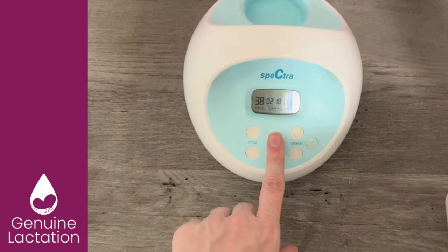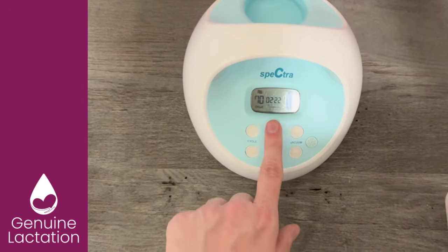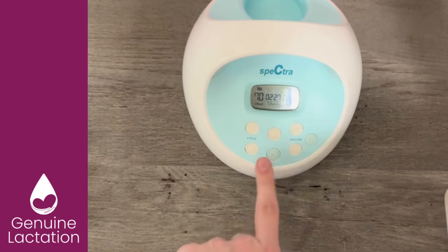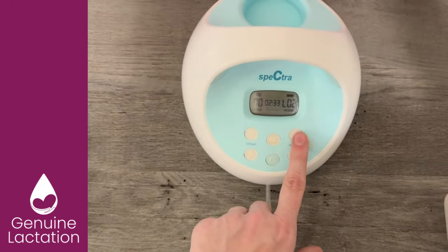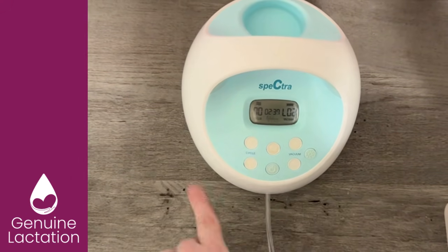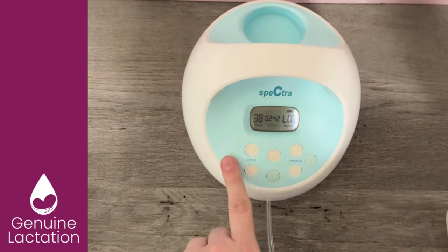Once you are seeing that milk is just trickling because we've moved most of the milk from that letdown, we're going to again hit that massage button. If you feel like it's too strong going back, go ahead and drop it down again. If you need to drop it down 2 levels, that's fine. Some people need to adjust their settings with every letdown, some people don't. So again, once you see milk readily spraying and flowing again, we're going to go back to expression.